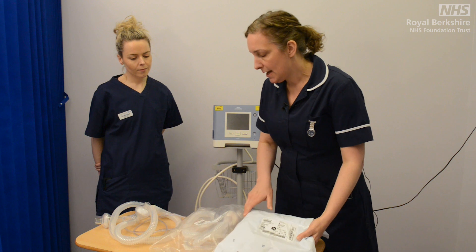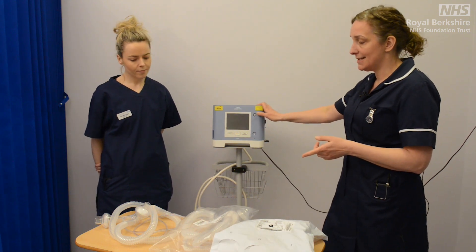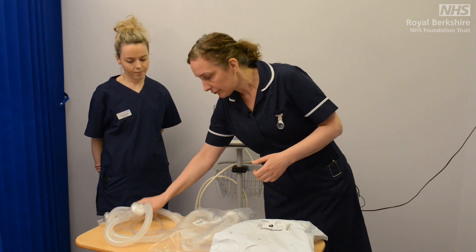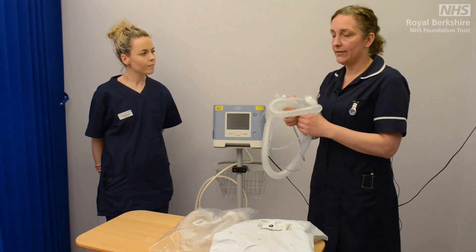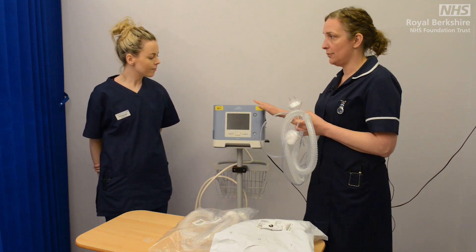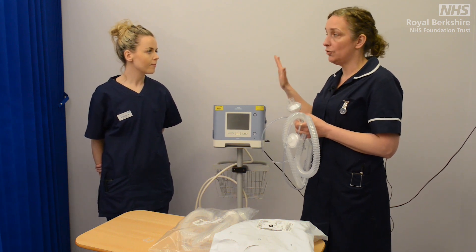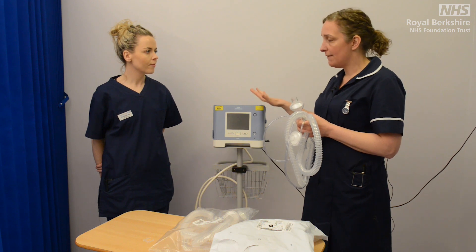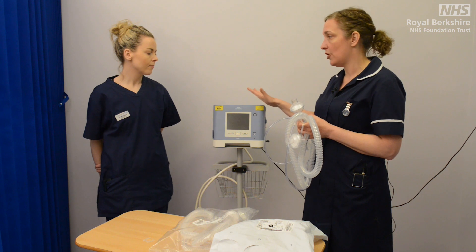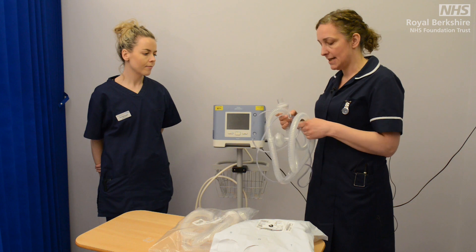Before we start to actually program our ventilator, the first thing we'll need to do is take our tubing out of the packaging and prepare that. These are a one-size-fits-all ventilator tubing. This is a ventilator that we're using for CPAP — continuous positive airway pressure — or for BiPAP, which is biphasic positive airways pressure or spontaneous timed mode, but they have the capacity to do lots of other ventilation settings.